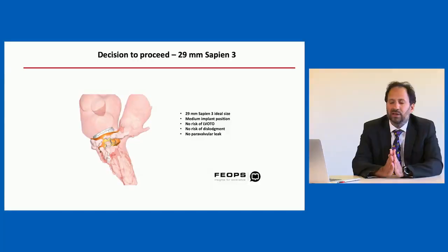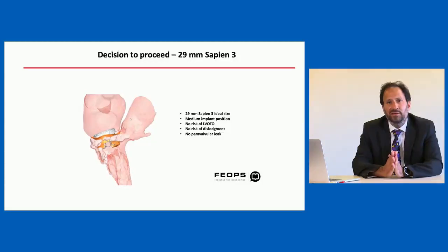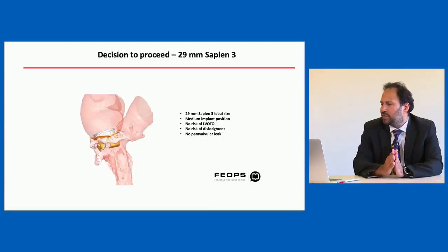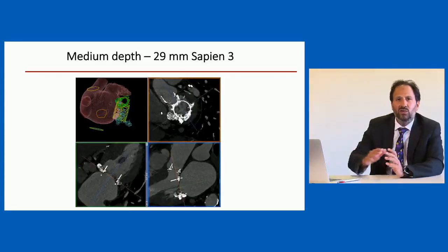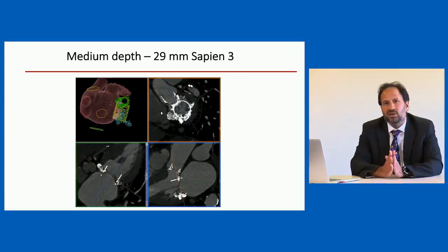And by a medium implant zone, I mean that the deployment is 50% in the left atrium and 50% in the left ventricle. So what we can do is to use all of the simulations that we've acquired using our FEOPS platform and our colleagues from Belgium, and to make this available for our interventional cardiologists directly in the cath lab with the Valve Assist platform courtesy of GE.